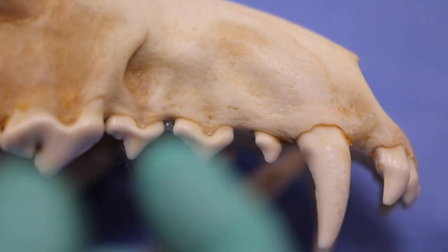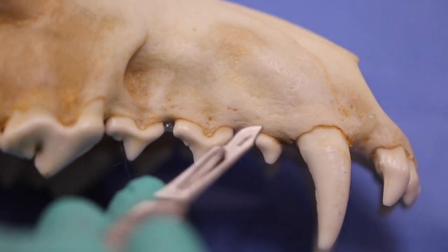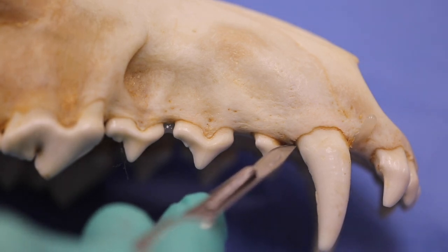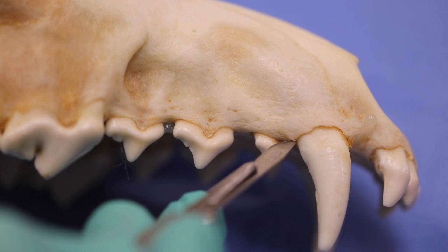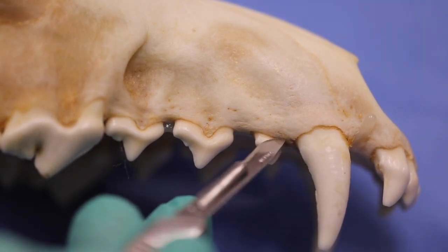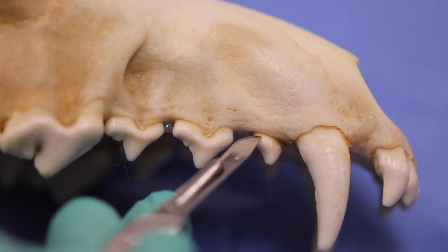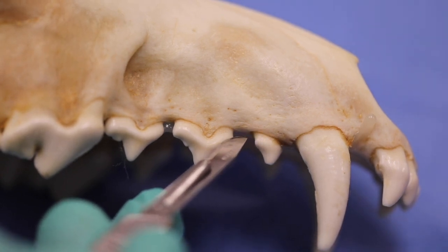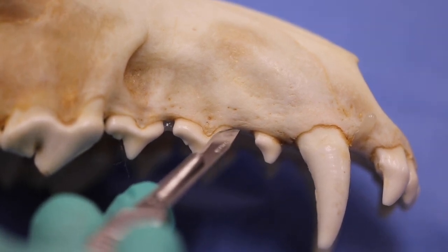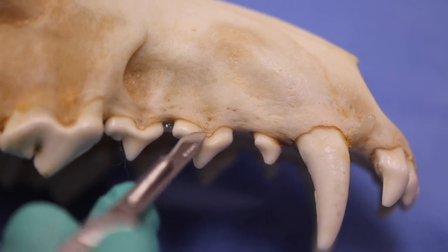So what we want to do is make sure that when we make these little stab incisions, we start at about a 15-degree angle. We go at the margin of the gingiva, take it up underneath that gingiva in the sulcus, and make these little stab incisions as we go. Having that at least 15-degree angle means we're pressing that down, going through the junctional epithelium, and landing on that marginal bone.